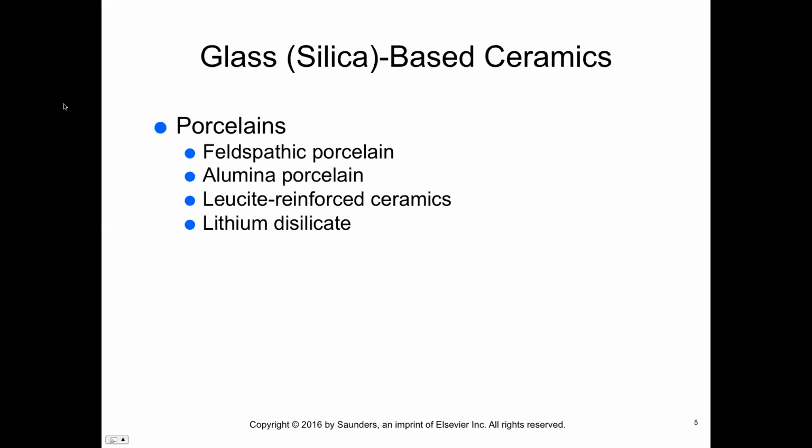So you want to make sure that the material being used in the mouth, like for instance, a crown on tooth number 30, which is in the posterior, can handle the pressure from chewing and biting. Oftentimes you can see older porcelain fused to metal crowns on a patient, and you can see the porcelain has completely worn off, and you can see the metal through it. That just shows how heavy a person's bite can be, and especially over years of being in the mouth, you can also see the wear on the opposing tooth as well.